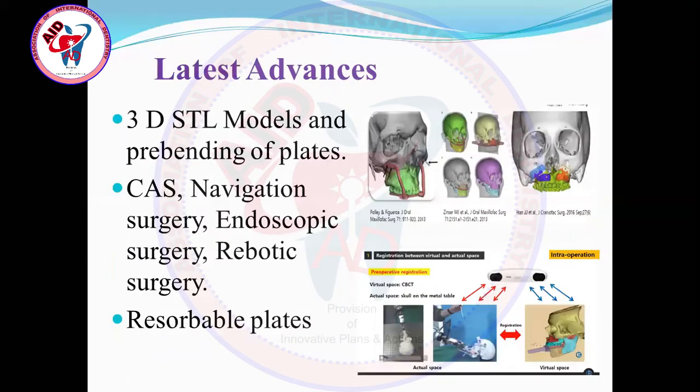These are the latest advances. This is the last slide, I think, second last. Latest advances, not now in present Pakistan, but people are doing internationally using these techniques. They take the 3D reconstruction image of the patient. That is a DICOM image, and with the CAD/CAM technique, from that image a stereolithographic model of the traumatized patient is made, with acrylic or polyurethane.